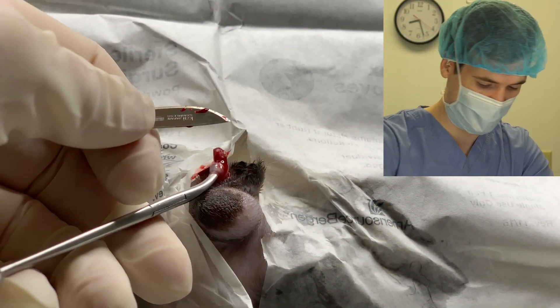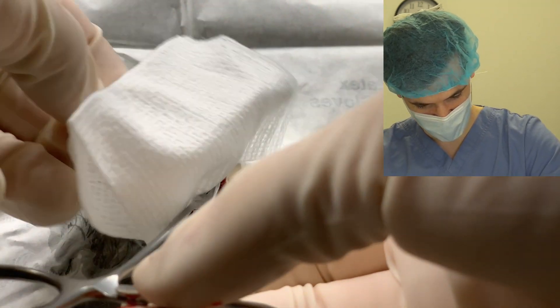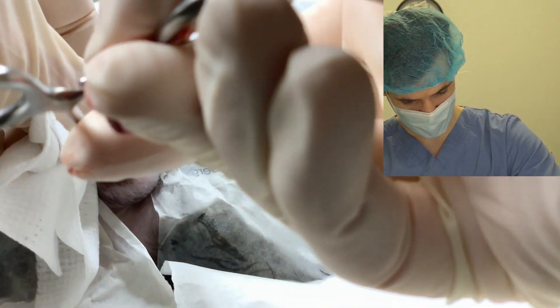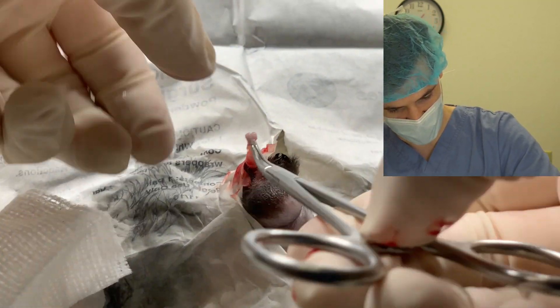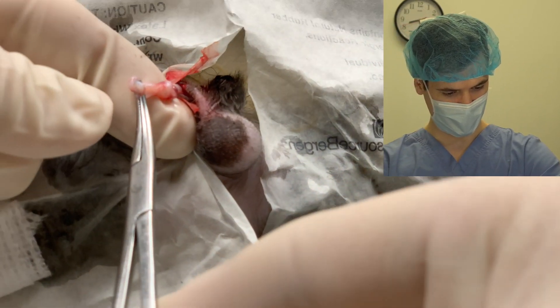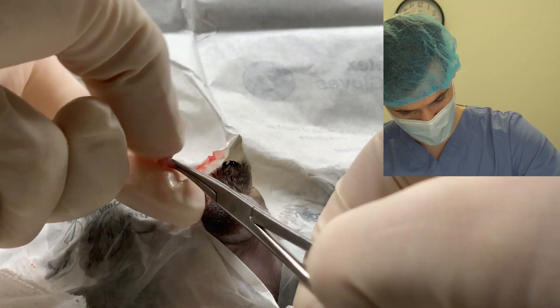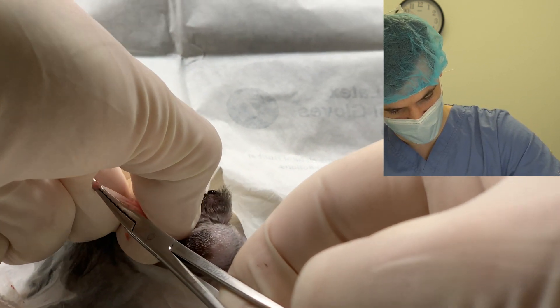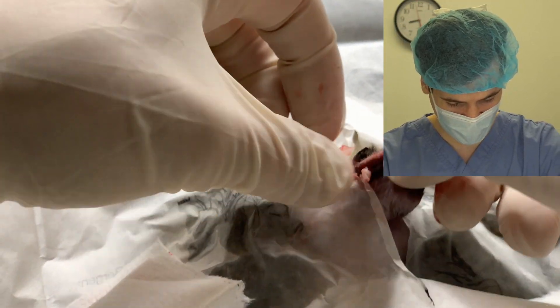The testicle is off, so I'm gonna drop that. Now we're gonna take a piece of gauze and slide that tissue over the hemostat like so. That's gonna form a little knot. We're just gonna tighten that knot down, get it really tight — that little knot right there — and then it's good to go. We're gonna drop that back in and let it fall naturally into place.